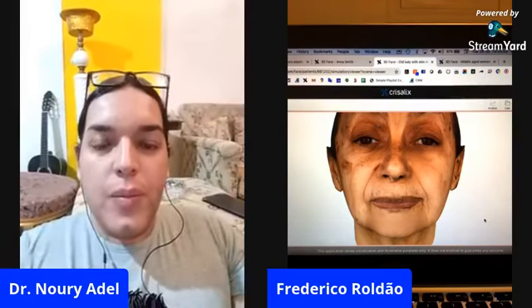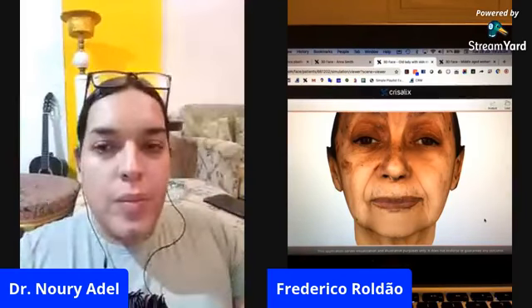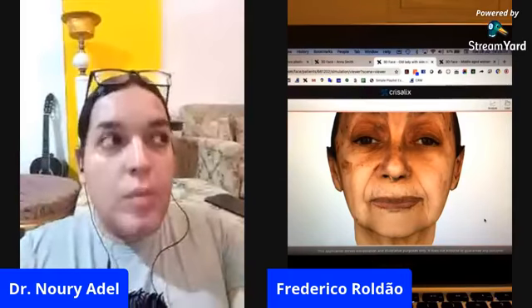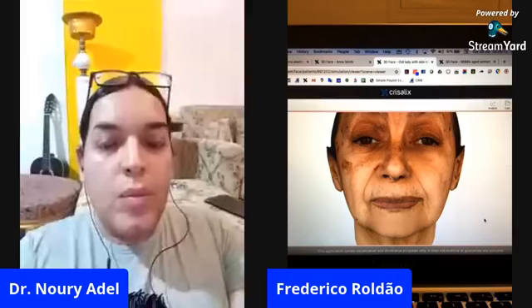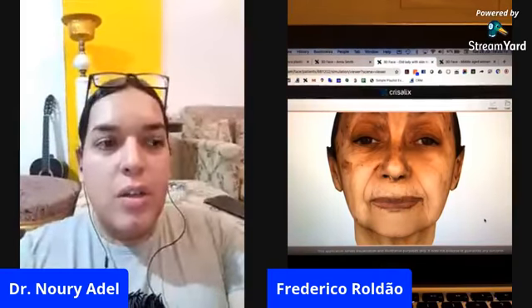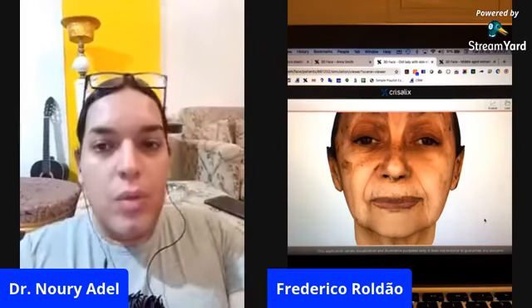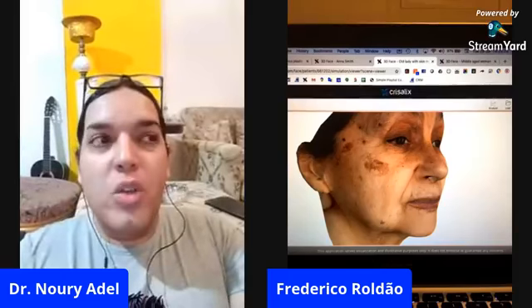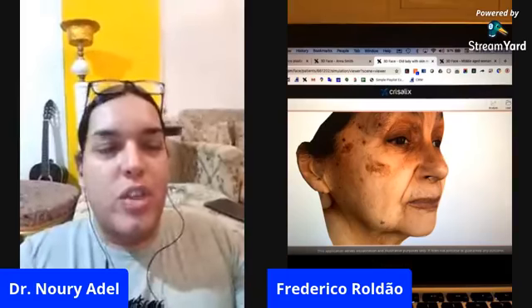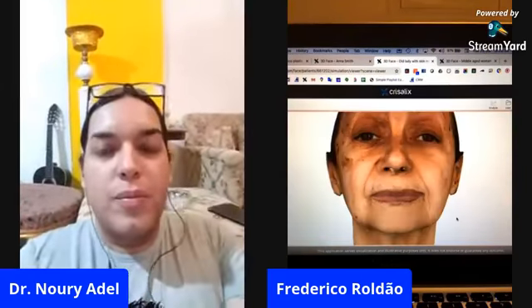It's better to keep one standard position, but you can create a 3D in any position that you want. So if you want to create a 3D while the patient is frowning or while the patient is smiling, you can do that. Can we use it on videos also, or just on pictures? Not on videos, no, just on static images. Okay, I see. But you are right, because once you see the 3D before and after pictures, you can merge the pictures along with each other, and you can give it like a dynamic picture, as if she's smiling and returning back to rest, and so on.